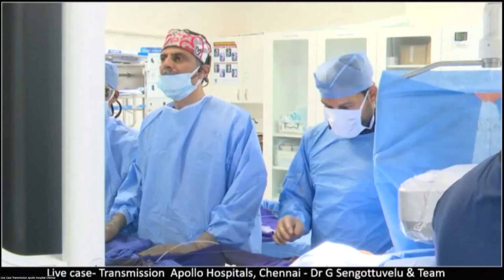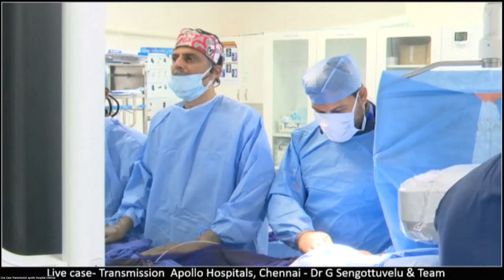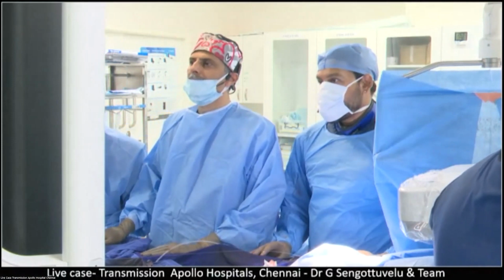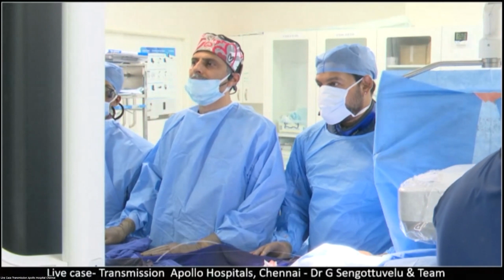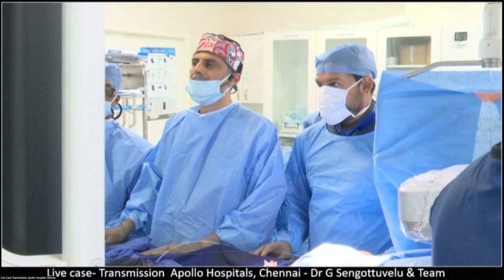Maybe one final comment. I would suggest going to cardiac CT again to do a scan for future information. We do a lot of post CTs because we learn a lot from them, not only for the acute result, but for planning for the future.